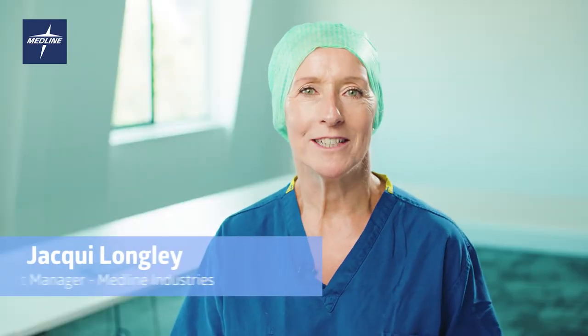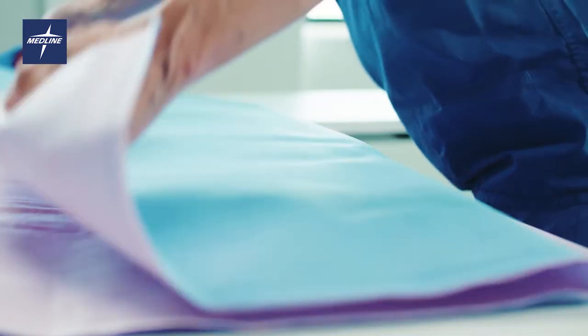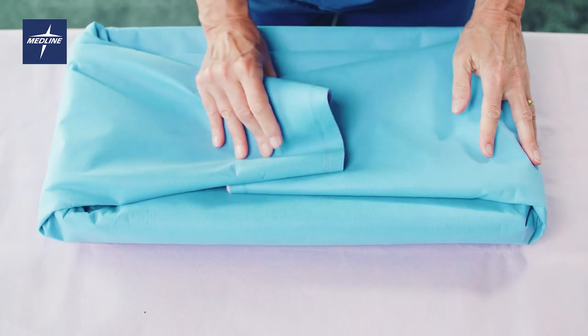My name is Jackie Longley, Product Manager from Medline. In this video I'm going to demonstrate how to wrap with Gemini bonded sterilization wrap.